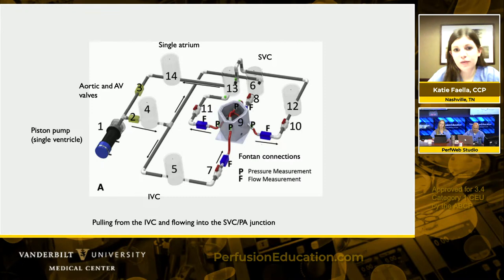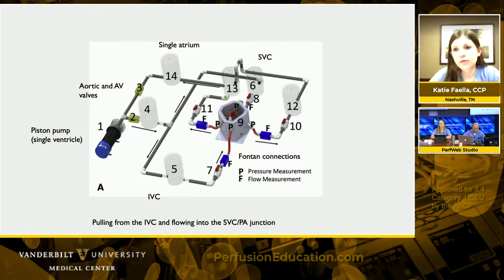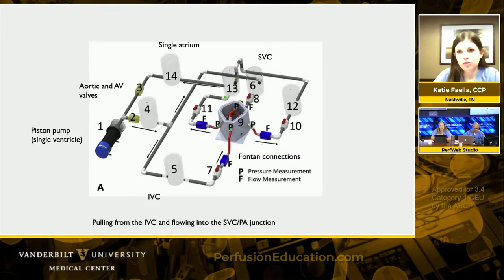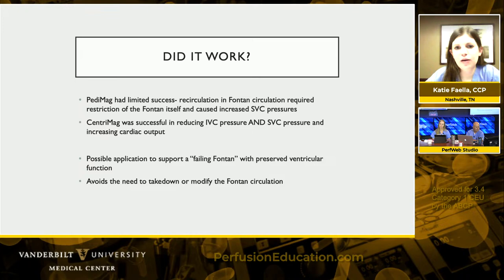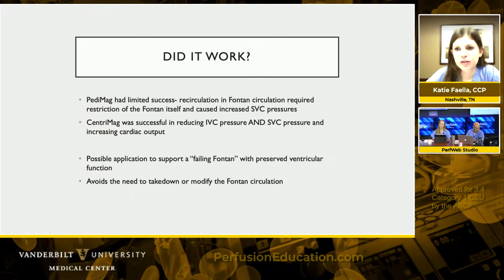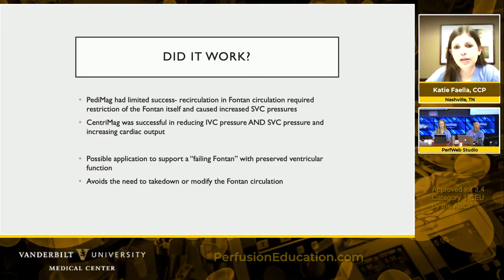So they used an in vitro model, and they also used computer models so that they could do 5 different patients across a range of sizes and anatomies using the CentriMag and the PediMag. So did it work? They did find that with the PediMag, they only had limited success. There was a lot of recirculation in the Fontan circulation that caused high SVC pressures. The CentriMag was more successful in reducing the SVC and IVC pressure and increasing cardiac output.